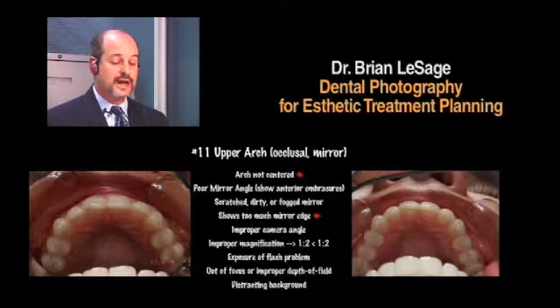Now when we look at the last two views, 11 and 12, really are occlusal views. And so we'd like to get at least back to the first molar. These pictures I was taking by myself. This is almost impossible to do by yourself. I won't say it's impossible, but it's certainly nice to have an assistant there.